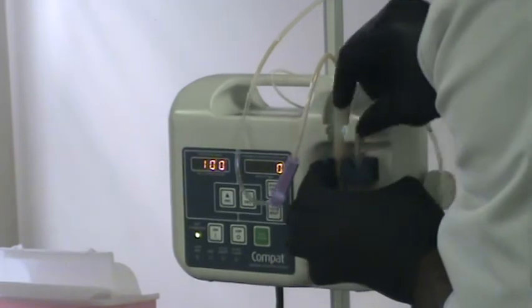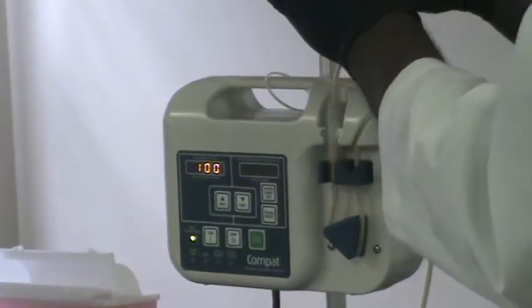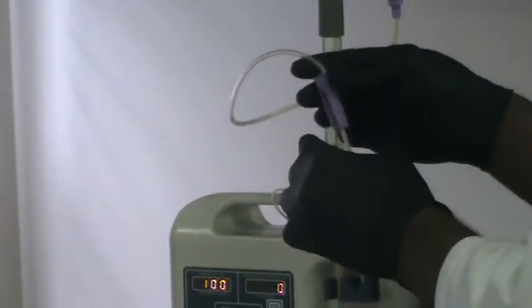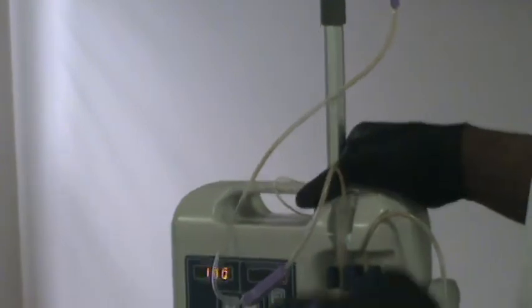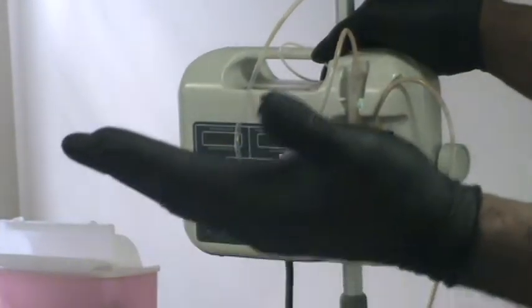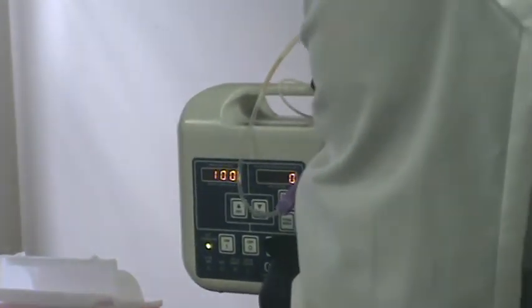Bring it up and put it right there. Unclamp it so it will flow. So that's beeping because he's been waiting for 5 minutes and nothing happened. So it beeps. So press hold.